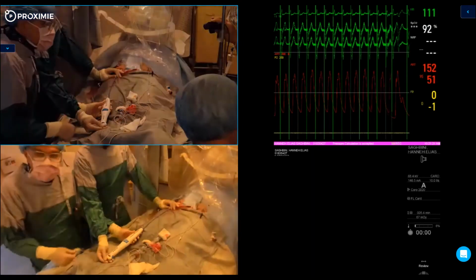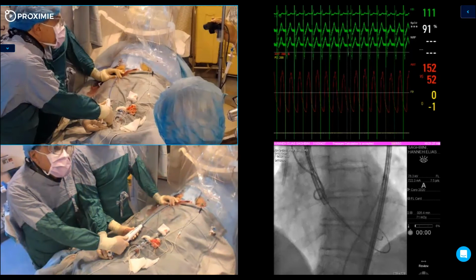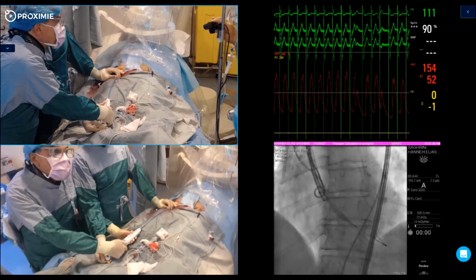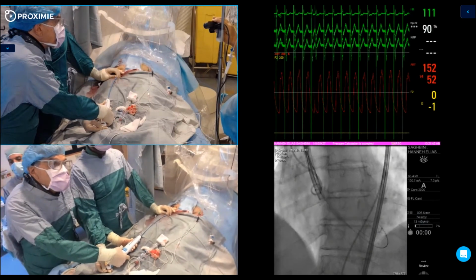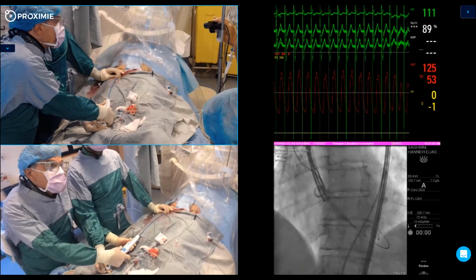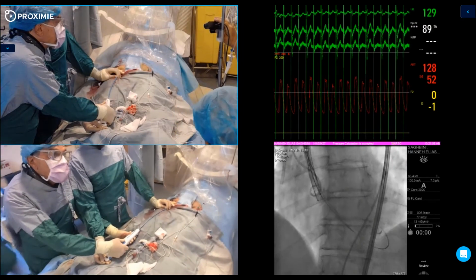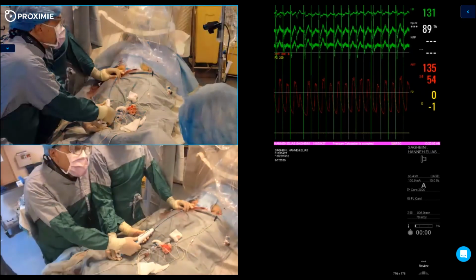Who has the injector? Inject. Okay, that's beautiful here. Do one turn. Okay. One turn. Can we pace at 120, please? One turn. 130, please. Okay, one turn. You see, it's not moving at all. So where I started, this is the beauty of the system. It's very stable during deployment. One turn. Inject.